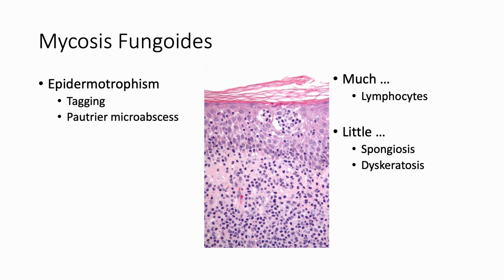It is characterized by epidermotropism, meaning there are some weird atypical lymphocytes going into the epidermis. Usually in an inflammatory skin disorder, there can be epidermal lymphocytes. However, in that situation, you should see some reason: either there is spongiosis or there is some dyskeratosis, and the lymphocytes are targeting that pathology. In mycosis fungoides, there is no particular reason, but the lymphocytes are going into the epidermis.